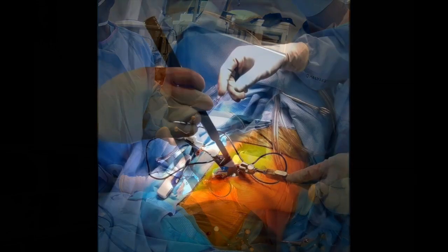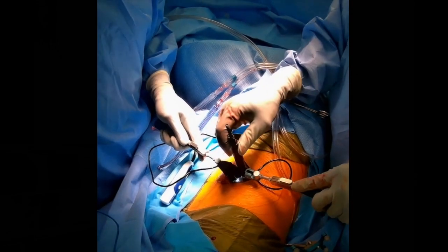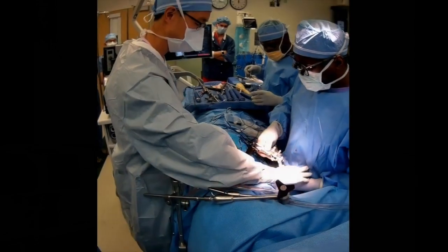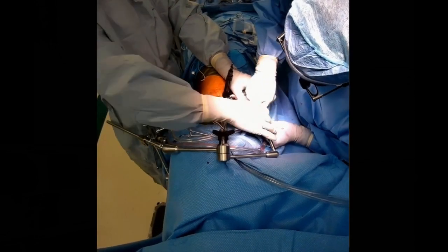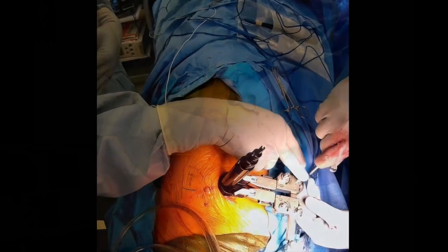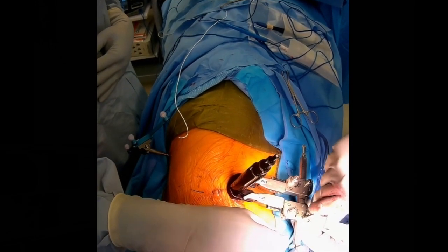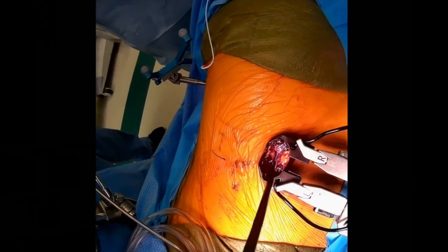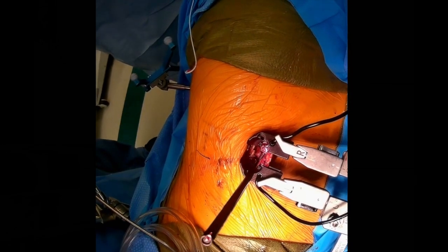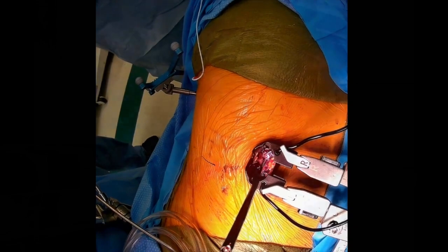Lighted retractors are then used to dissect to the psoas muscle, anterior to the spine. Navigation confirms position, and after confirming positioning the dilators are placed in order to place the retractor. Here you can see how the table-mounted retractor is positioned and placed with an oblique angulation towards the posterior aspect of the spine. The width of the minimally invasive tubular retractor is 22 millimeters and this can be expanded as necessary.